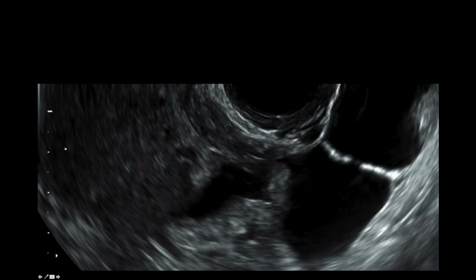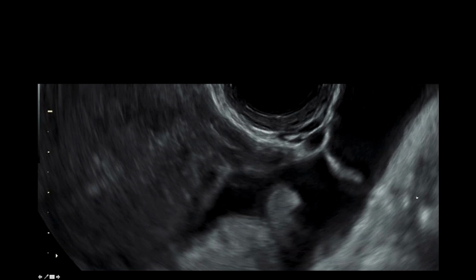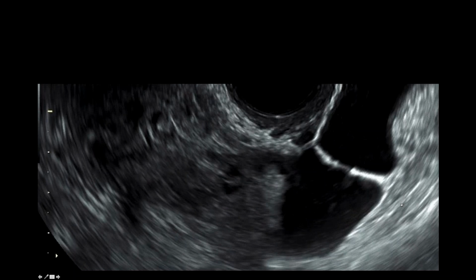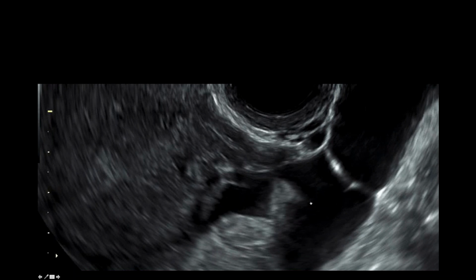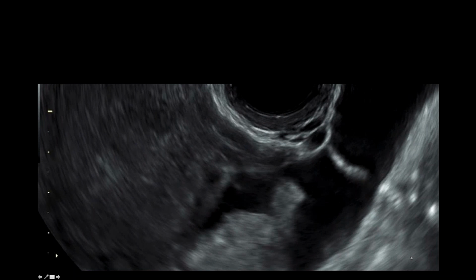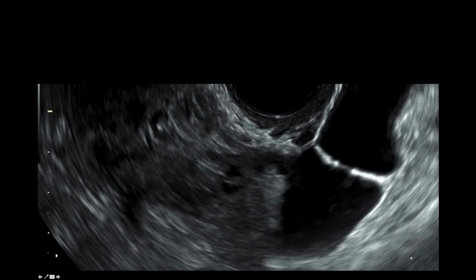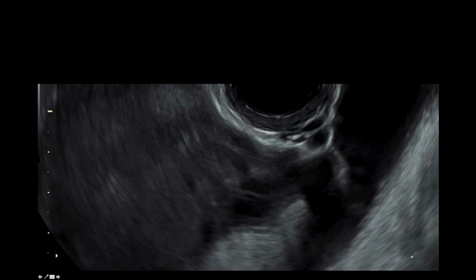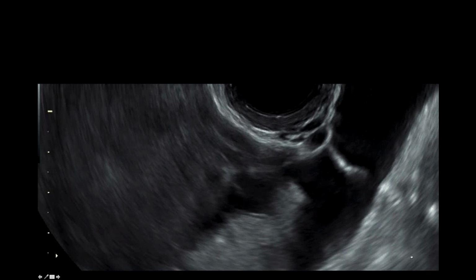Okay, so here's the uterus over here, and this patient was sent in to us for a pelvic mass, a left adnexal mass. Still image, sure, I see a mass over here. I know this is her uterus. I see this. I'm thinking this is a septation. But what happens when I start poking around? Well, what I notice here is this moves when you apply repeated pressure. Okay, this is a peritoneal inclusion cyst. And what we're seeing here are the fimbria waving to us. So as opposed to being a nonspecific adnexal mass and referring the patient to gyn-onc, by poking very gently, you just repeatedly probe that area, we see that these are filmy adhesions, and they allow the fluid to move within it, and we can see that this is the fimbria.